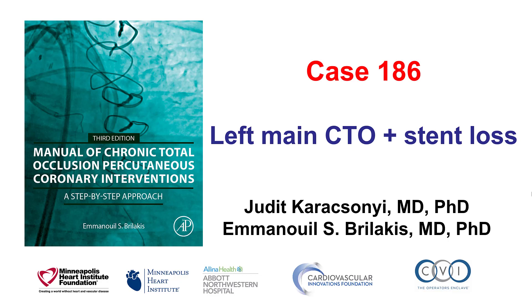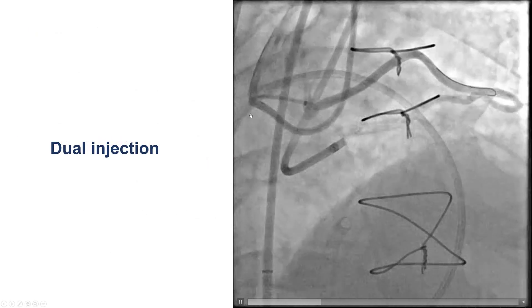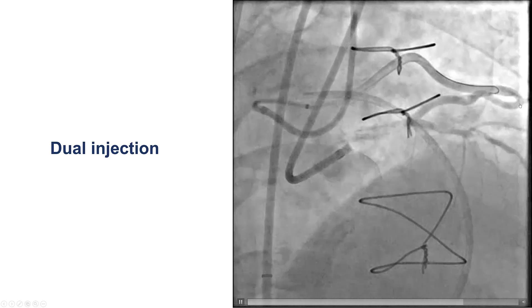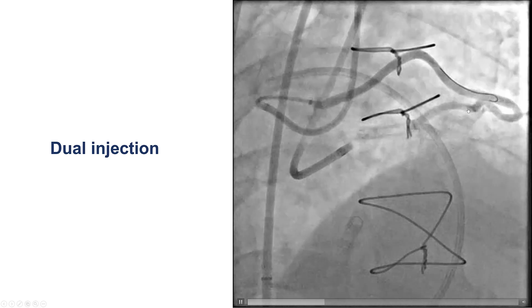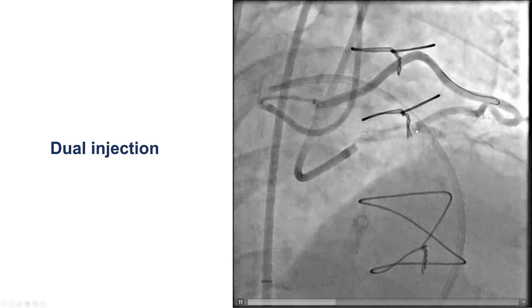This is a case of left main CTO that was complicated by stent loss. The patient presented with severe angina. He had previous coronary bypass graft surgery 19 years prior, and had also undergone PCI of the left main 16 years prior with two Taxus drug-eluting stents. He was found to have a lesion in the right coronary artery that was successfully treated, but he also had a significant lesion in the mid-LAD that was filling retrograde through the radial graft. This is the angiogram of the radial graft anastomosed to the diagonal branch, with retrograde filling of the LAD showing a significant lesion immediately distal to the origin of the diagonal branch.